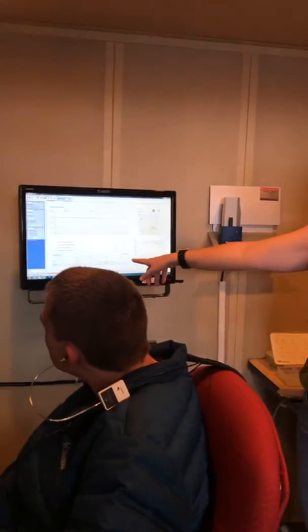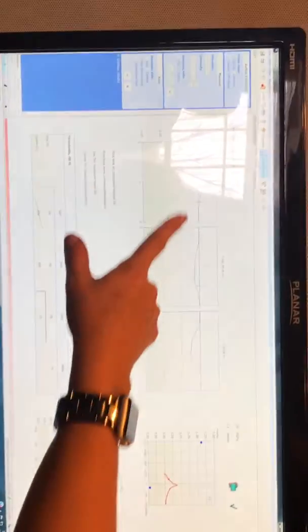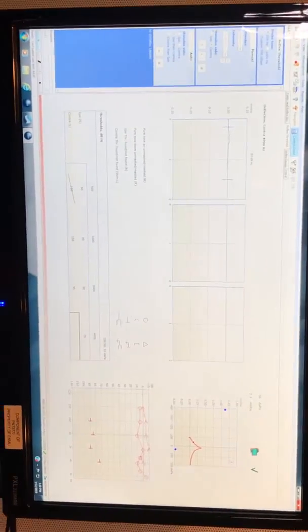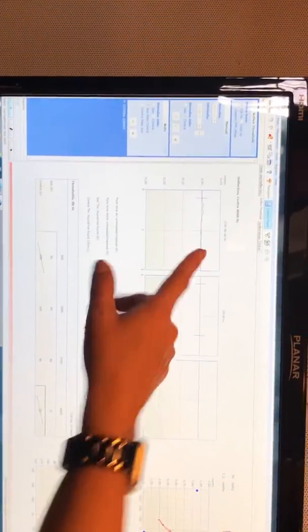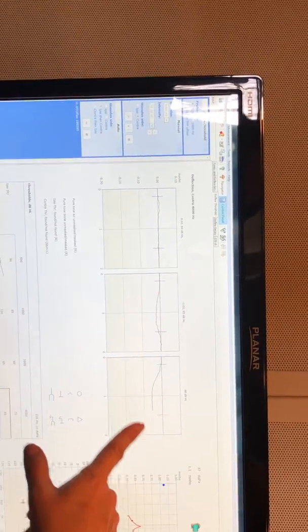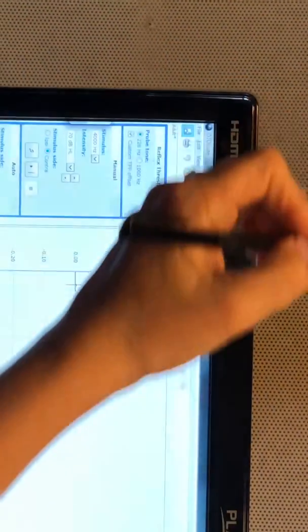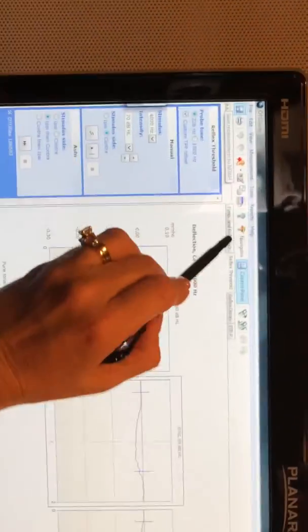Keep going until we finish the test and then we'll look at it. You can see the drop where the response is — no response, then a response, and they're looking for it to grow. At 4000 Hz there's a good response at 85 dB. Now we have all of our thresholds for ipsilateral and contralateral. Always save before you go to the other ear.